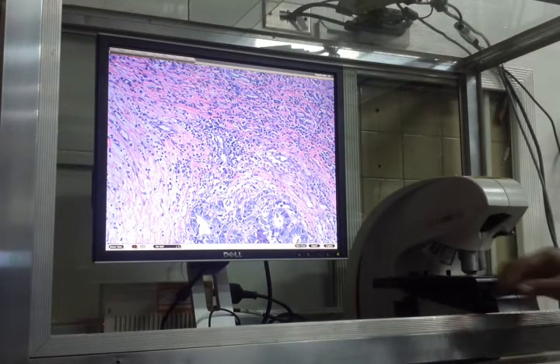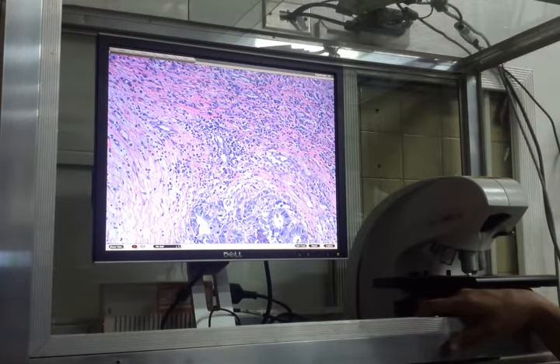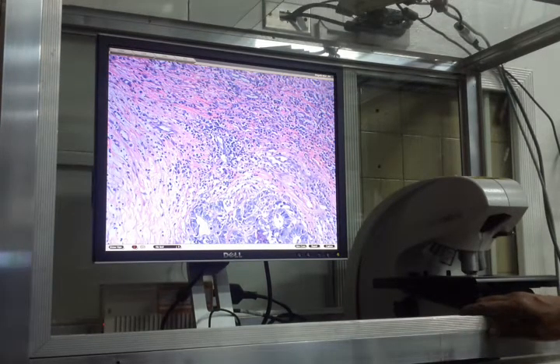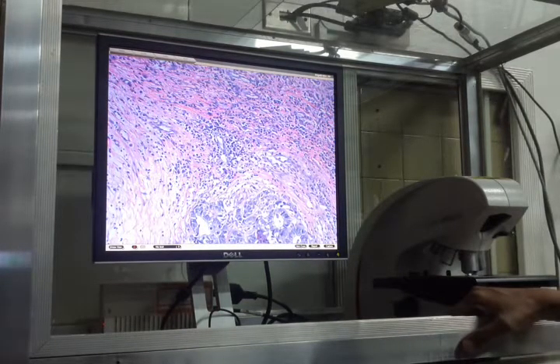So, ang pinakita dito, invasive malignancy, adenocarcinoma. Pinakita sa inyo ang cribriform pattern. Pinakita sa inyo ang dysplastic changes. Pwedeng tanong sa inyo kung ano-ano yung dysplastic changes. Pwedeng tanong sa inyo ang inflammatory immunologic stromal reaction. Ano pa pwedeng? Pwedeng tanong sa inyo ang desmoplasia. Ano pa pwedeng tanong? Wala na akong maisip.